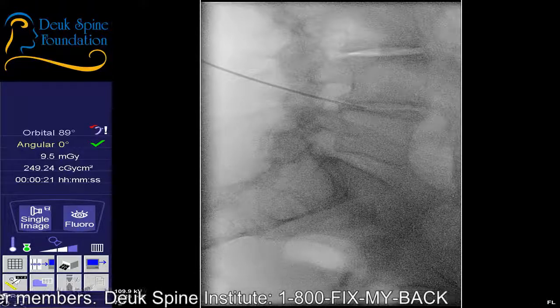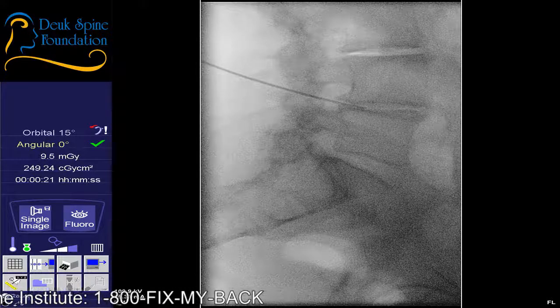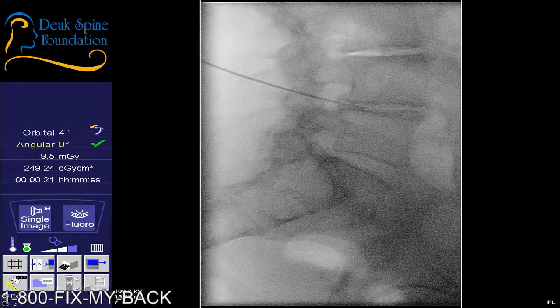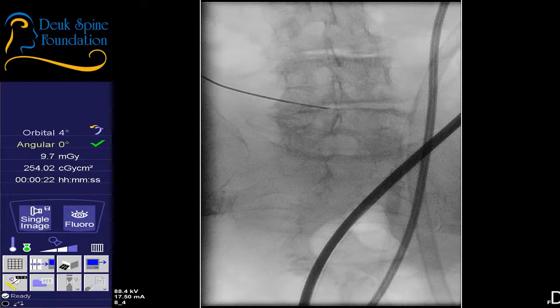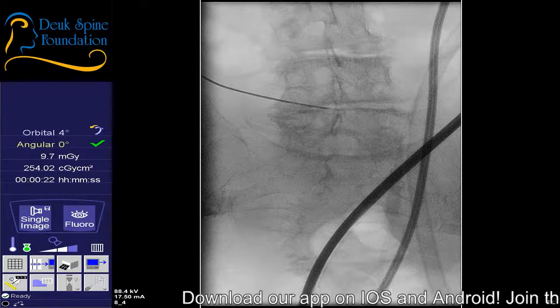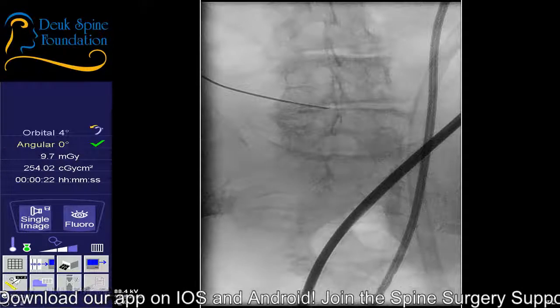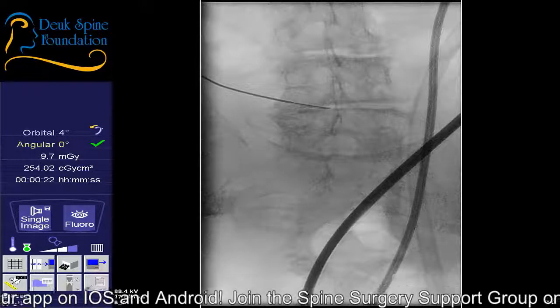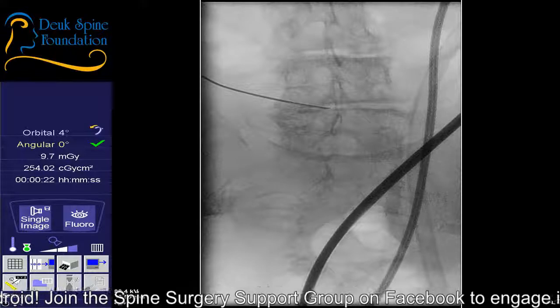That's pretty good. Let's get an AP, just to verify. So for those of you who aren't sure, if you look at the bone, the square below the needle, that's the L5 vertebral body. And then there's a gap, which is the L5-S1 disc. Yeah, actually it's not too bad. All right, fine. We'll take it. Are you comfortable? Just stay where you are. All right, now it's time for our incision. We make a 7mm incision.